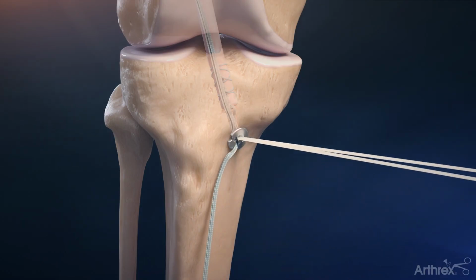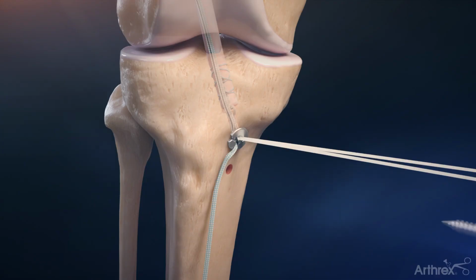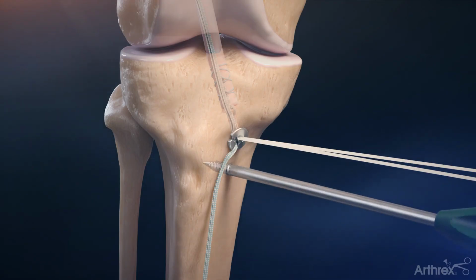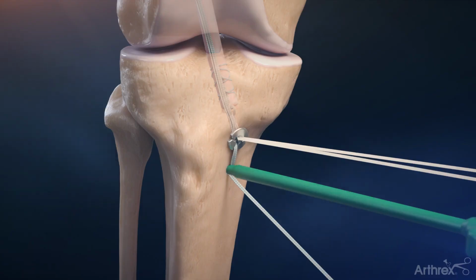Before tensioning the QuadLink construct, anchor the fiber tape sutures for the InternalBrace technique using the ACL backup fixation kit. Using the spade tip drill followed by the 5.2 mm tap, place the fiber tape suture for the InternalBrace technique into the eyelet and screw the 4.75 mm swivel lock anchor into the drilled hole.